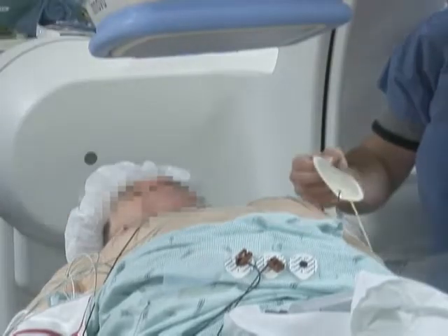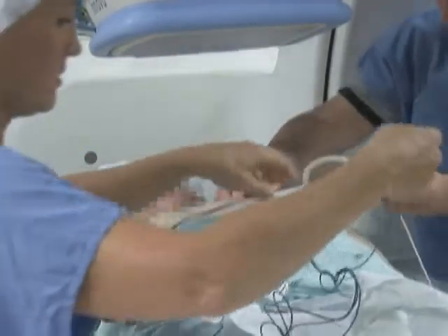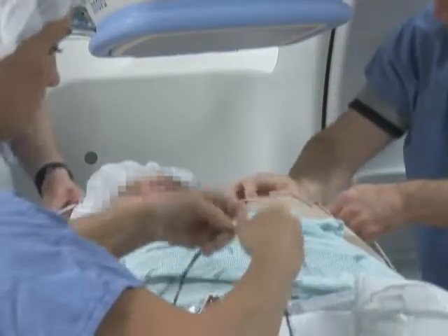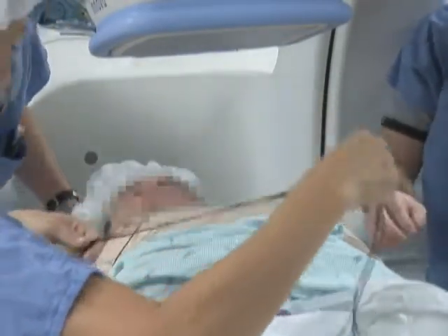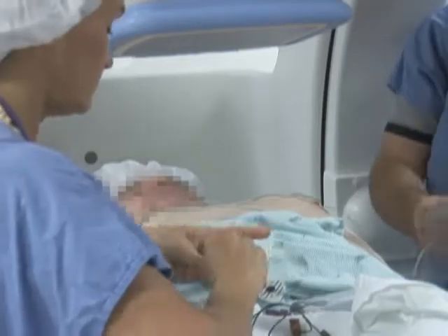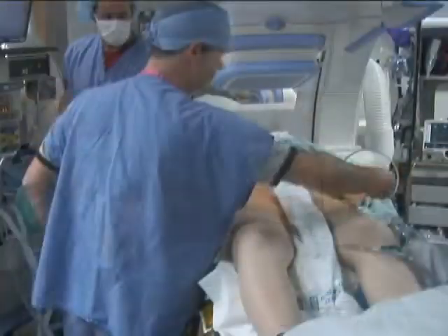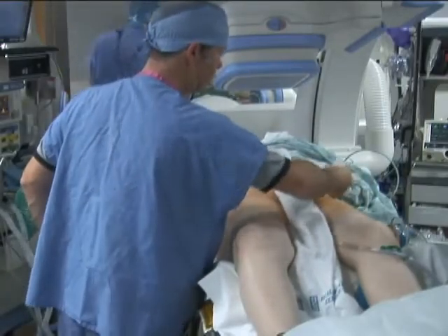The patient is brought into the electrophysiology laboratory, and defibrillation patches, grounding pads, ECG leads, blood pressure cuff, oxygen saturation monitor, and three-dimensional mapping system patches, if used, are applied. The patient is then prepped in the standard fashion.